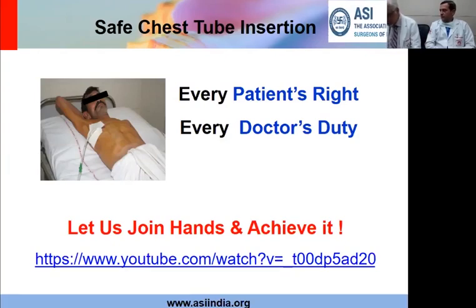One question that has come up is: would you always aim at the fifth intercostal space, or would you change, other than of course the situation of an encysted or loculated collection? Would it always be the fifth space, or would you change it depending upon the habitus of the patient, the sex of the patient? People have addressed these questions too.